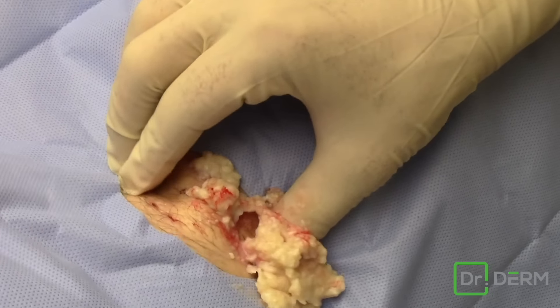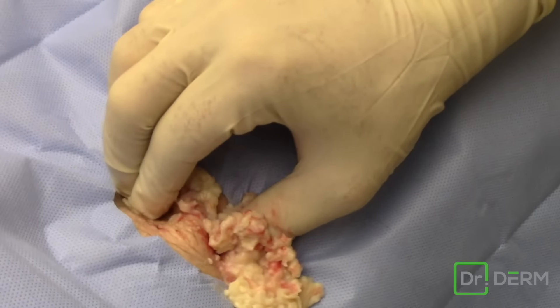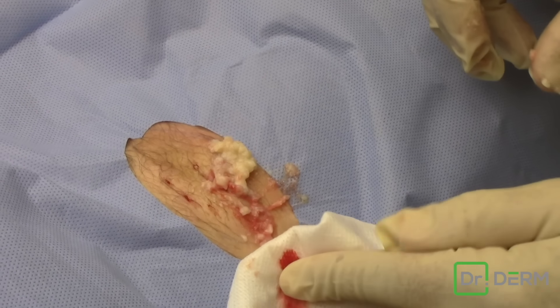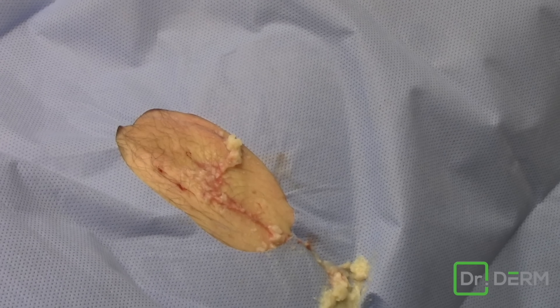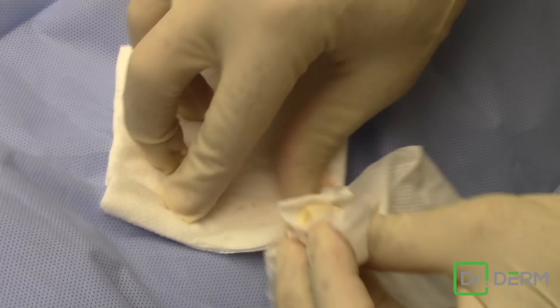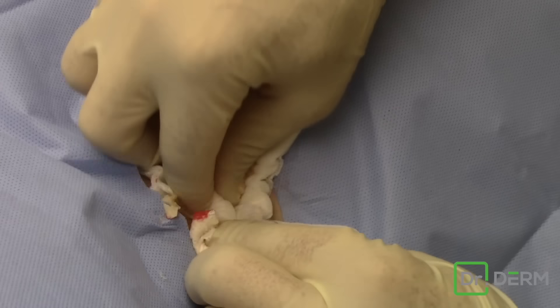Oh my gosh, this is a cyst. This is no lipoma. This is the cyst of cysts. I'll be darned. Big difference? Not a big difference in what we do, but yeah, that's a big old cyst. I'll be darned.